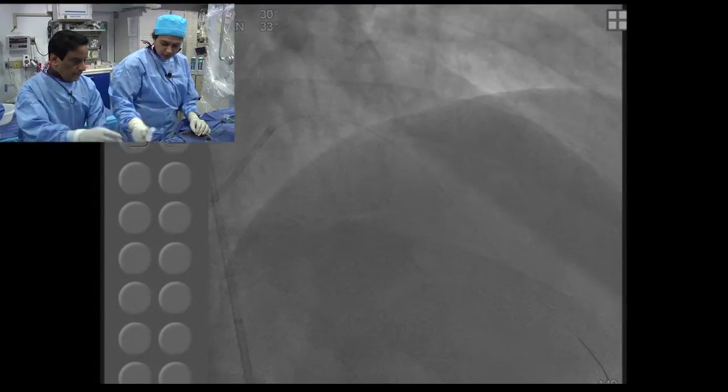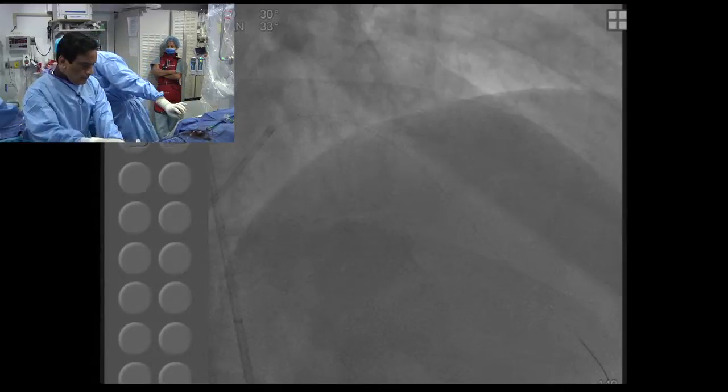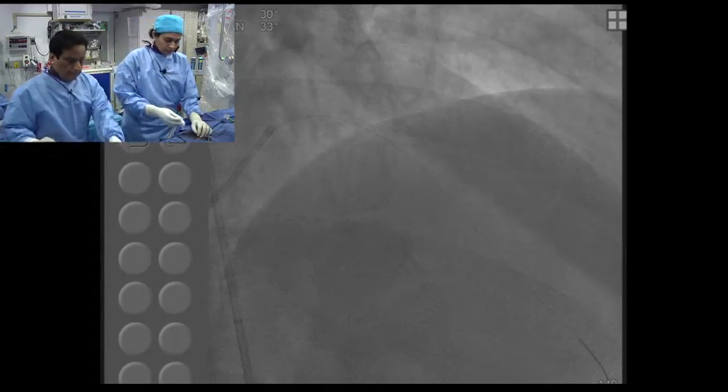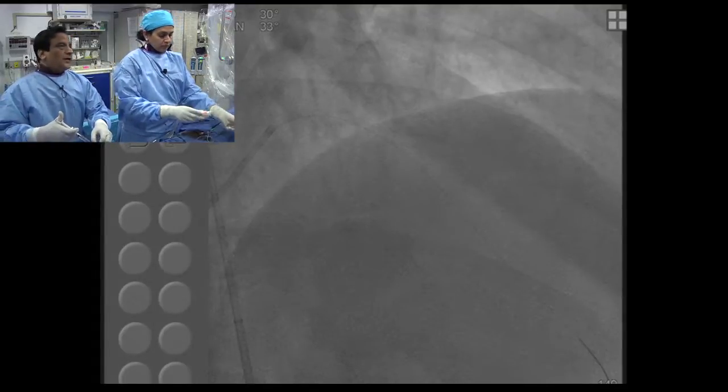Somehow I feel you're pulling too much. Okay. Look. Now we give a nitro. Okay, let's take a picture.